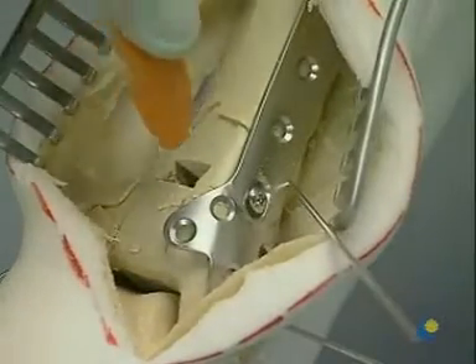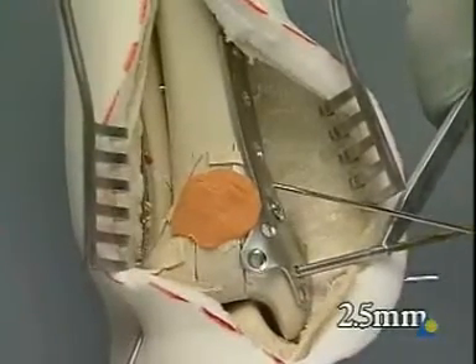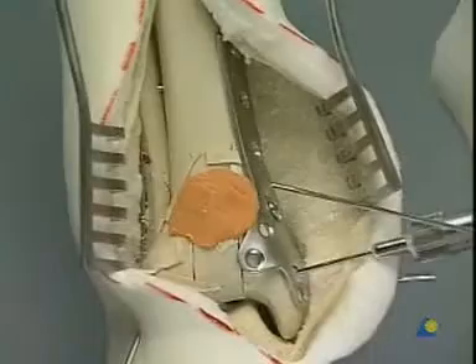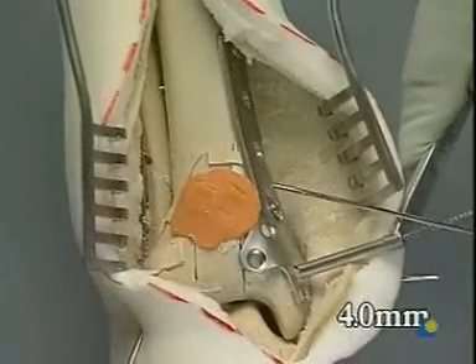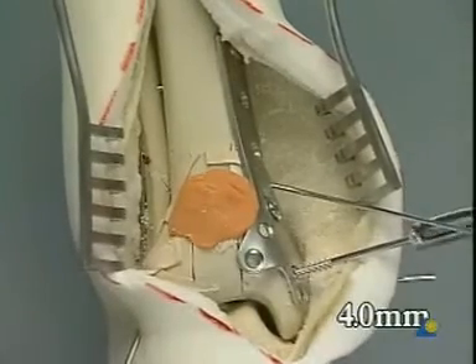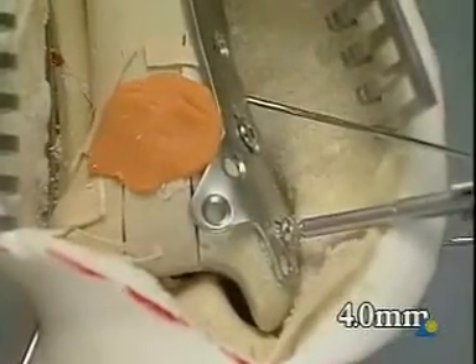The metaphyseal defect is now filled preferably with autologous cancellous bone, which should provide some mechanical support. Transverse compression of the articular fragments is obtained by placing a small cancellous screw distally through the three major anterior fragments. We drill with the 2.5 millimeter drill bit, measure the depth, and tap with the 4 millimeter cancellous tap. We can now insert the 4 millimeter cancellous screw. Good compression is obtained.